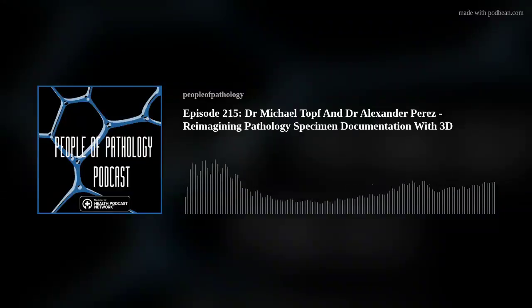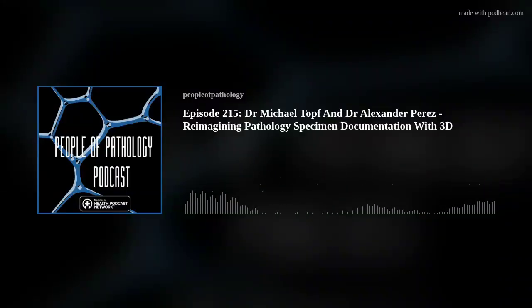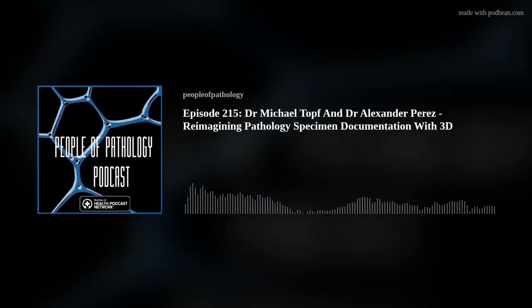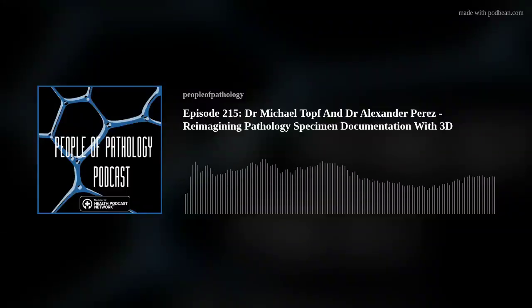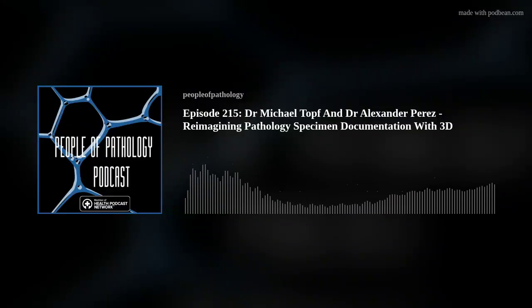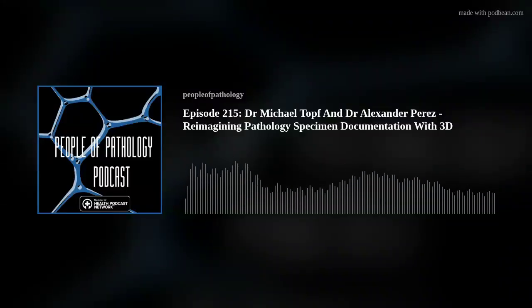Yeah, no, I think that's going to be the way to make this work for larger specimens. For smaller specimens, I have full confidence that what we're doing now even adds tremendous value. The next step is finding a way to get this same value out of larger specimens. Like you mentioned, if you have a resection of a bone, like a proximal femur megaprosthesis kind of resection, or you have a mastectomy or even a lumpectomy, these are bigger specimens that have a lesion on the inside, which the outside may be fairly homogeneous. It looks all like either fat or muscle or whatever. And so scanning the outside isn't as beneficial, whereas doing more comprehensive imaging of the slab, the cut surfaces, would be very beneficial as well.